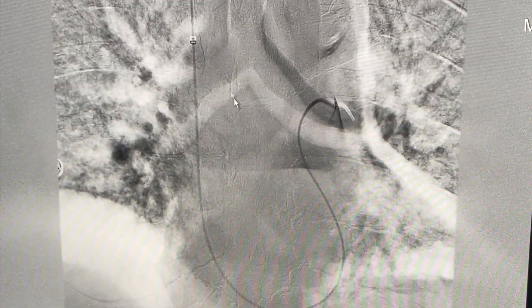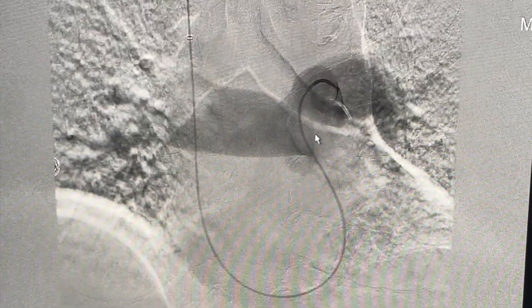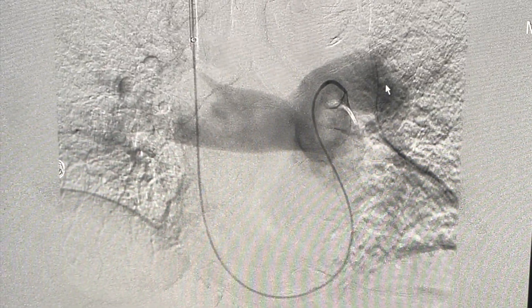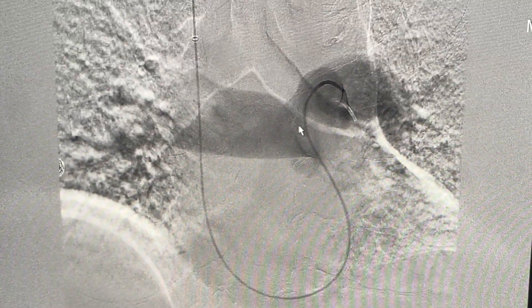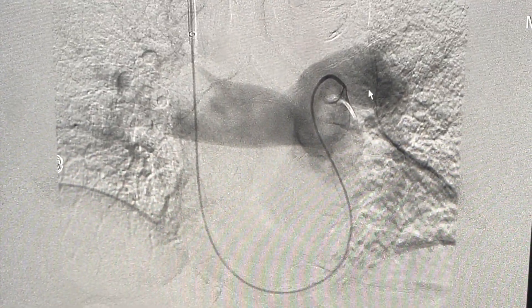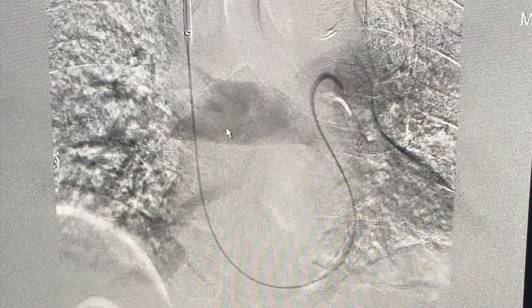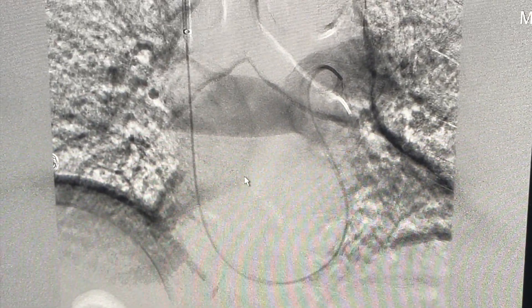Here again we have the wire in, deeper in the left main pulmonary artery. We're going to shoot some contrast to get a better idea of the anatomy. You can see it's parked mainly in the left side, but still filling due to pressure on the right side. This is the left main pulmonary artery here; here's the right main pulmonary artery. You can see the left main pulmonary artery has a lot more flow into the lungs, and on the right you see these big defects — a lot of clot burden — exactly what we saw on the CAT scan.